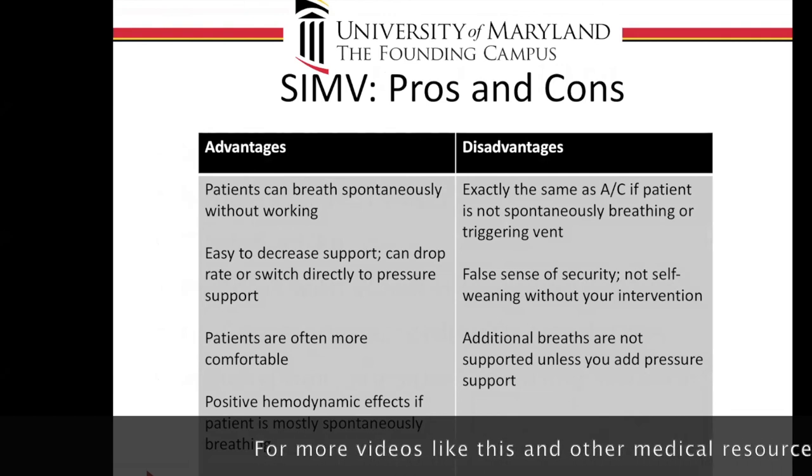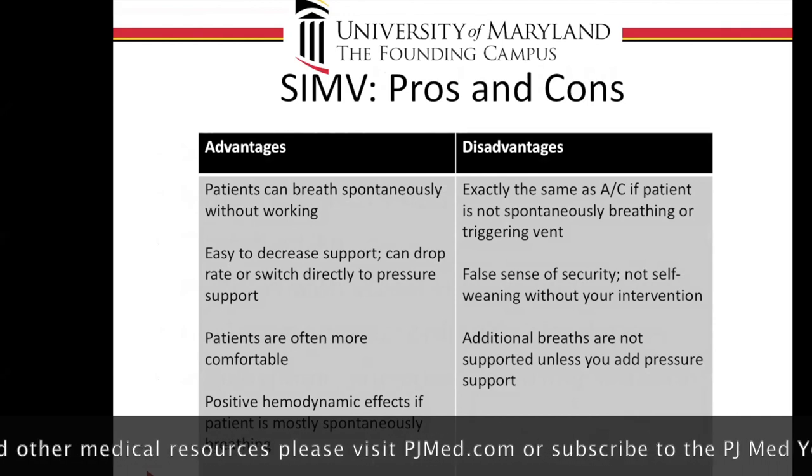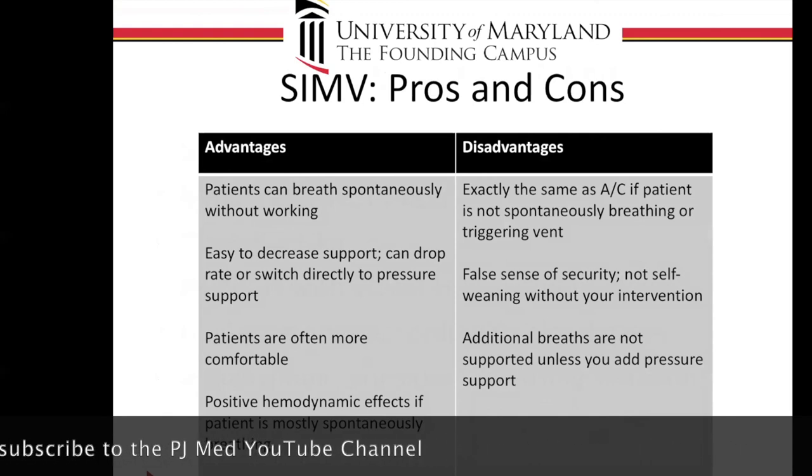You have to dial that rate down so that those mandatory breaths stop being as frequent. You can easily adjust the pressure support for modes, we'll talk about that in a second, in between, if you want them to have some supported breaths.